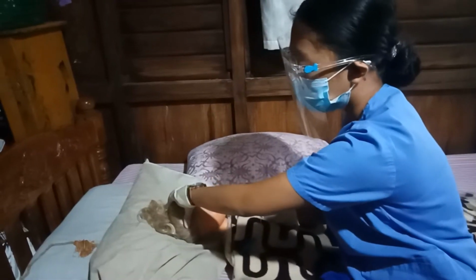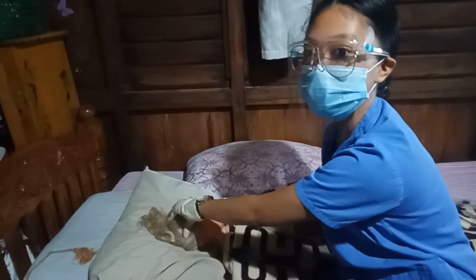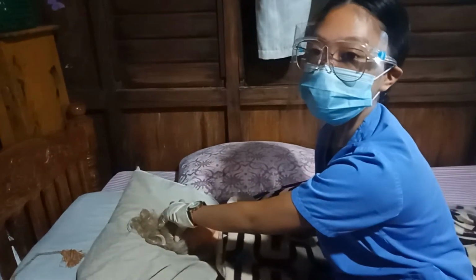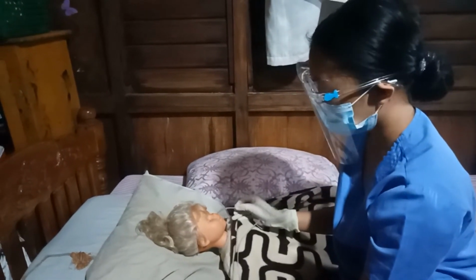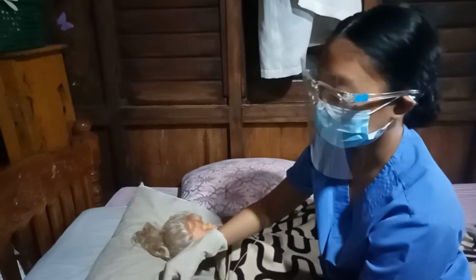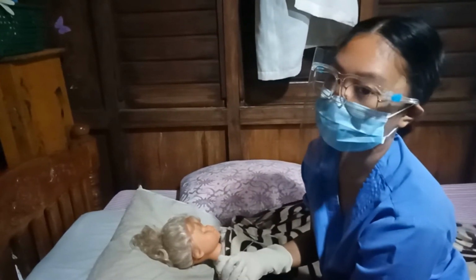First, we need to hold the forehead of the newborn so that it is steady and you are able to control it. Then, assuming that I am inserting the catheter now, next we need to attach this to the portable suction, and then suction it for 3 to 6 seconds only.